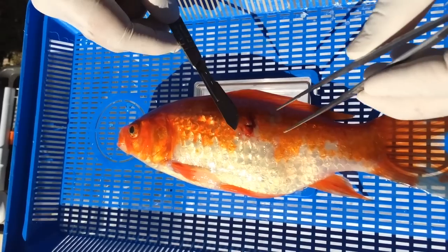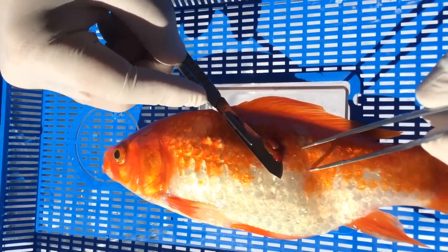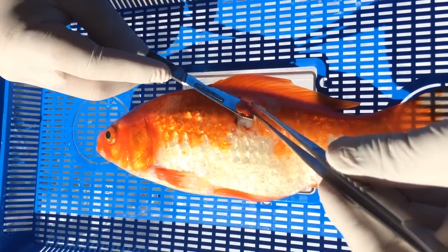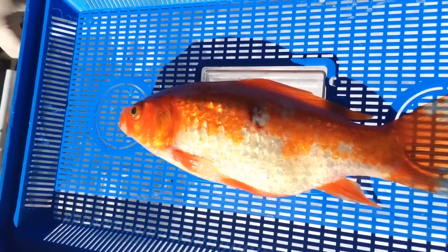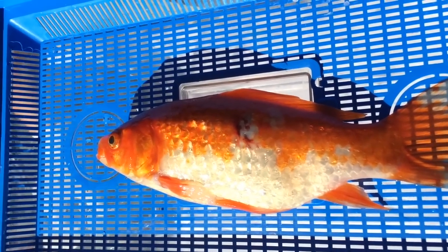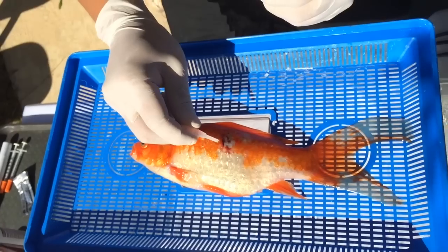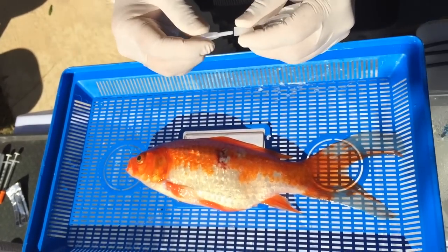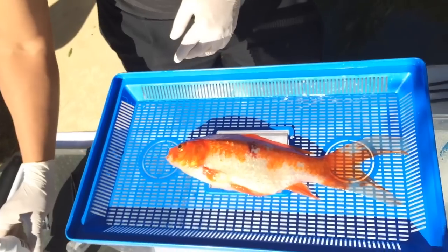So now that we've removed the scales we can try and get right down to the bottom and get rid of a lot of the neoplastic cells. That white area there — you can actually see that is the subcutis. Just a little bit of hemorrhage there; you can apply some sterile gauze as pressure over here. What I'm using is epinephrine, so that will help clot the blood over there.